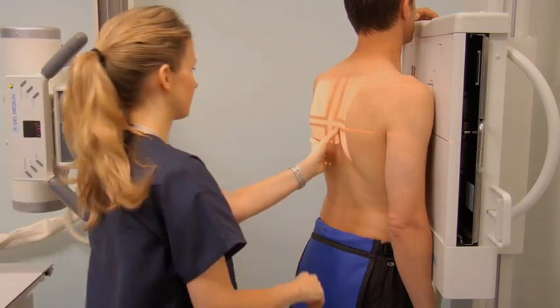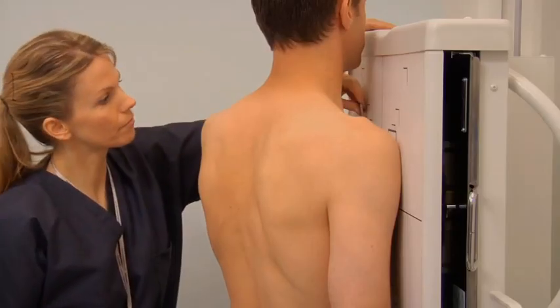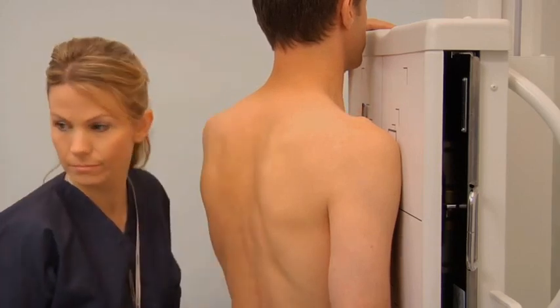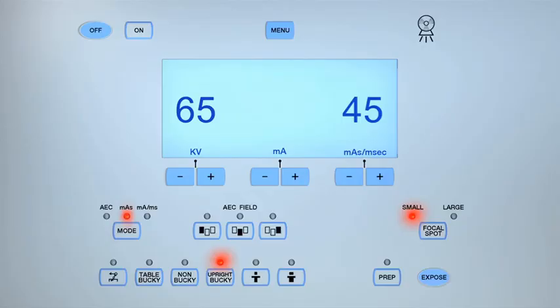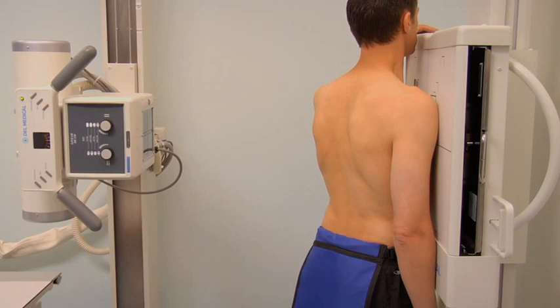Collimate to the sternum and include the jugular notch, lateral margins, and one inch below the xiphoid process. Position the lead marker in the upper corner of the image receptor within the light field. Stand behind the protective lead barrier and check that the exposure technique is appropriate for the patient's body habitus, making any necessary adjustments.